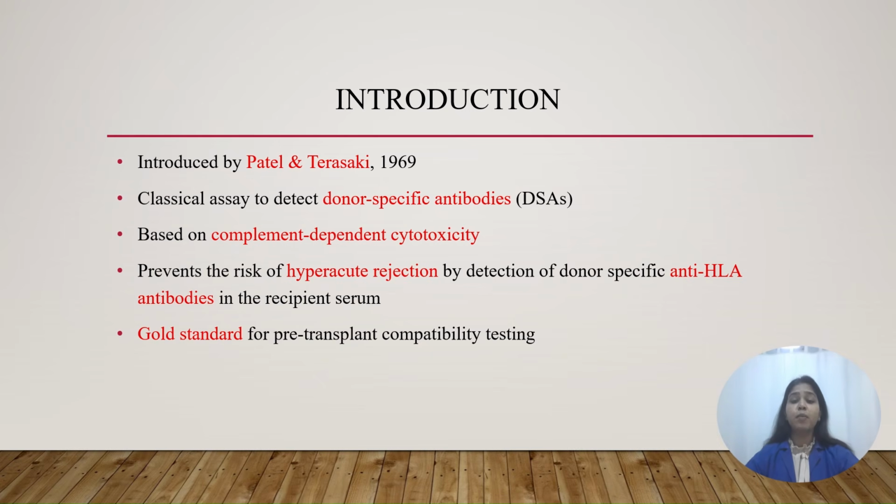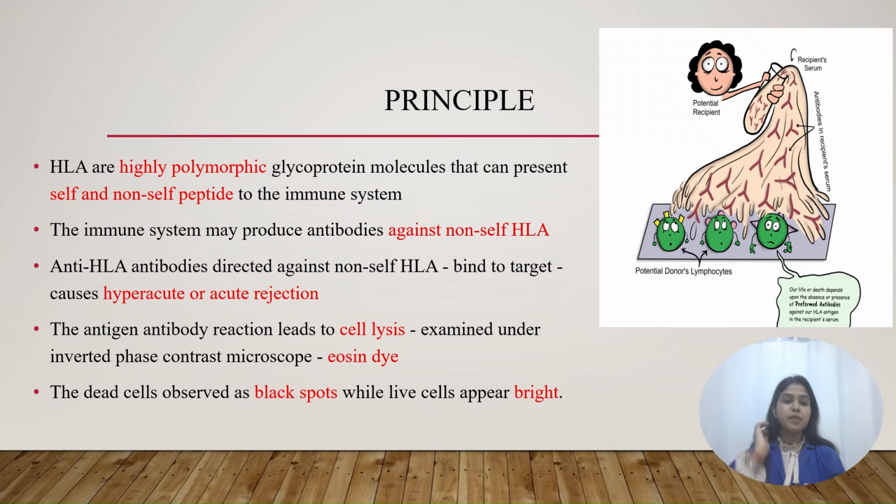It is based on complement-dependent cytotoxicity. It prevents hyperacute rejection by the detection of donor-specific anti-HLA antibodies in the recipient serum. It is a gold standard for pre-transplant compatibility testing. Here comes the principle of the CDC crossmatch.